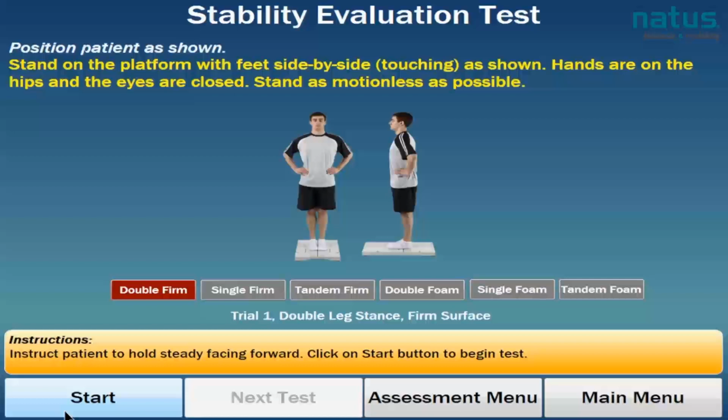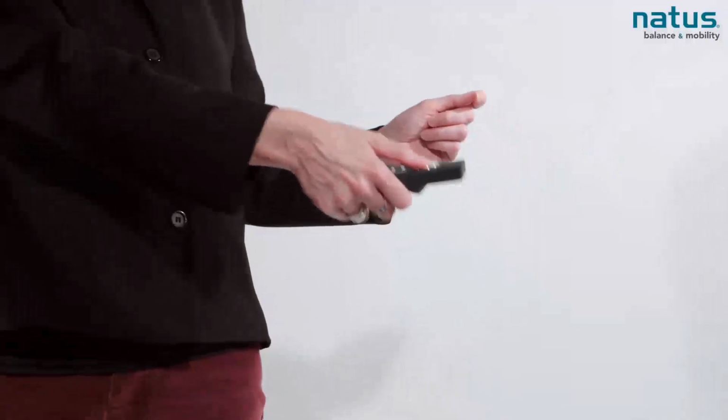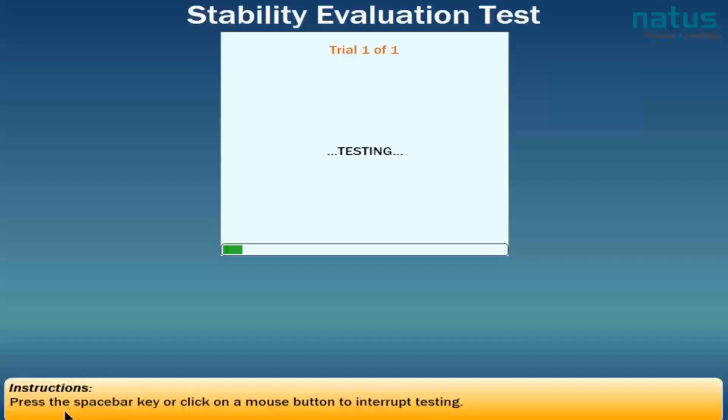When you're ready, I'm going to have you close your eyes and stand as motionless as possible. It's very important that the patient understand we want him to stay still as he can during the test. Are you ready? Ready. Okay, when you're ready, close your eyes. His eyes are closed and I'm clicking on the start button. This is a 20-second trial.